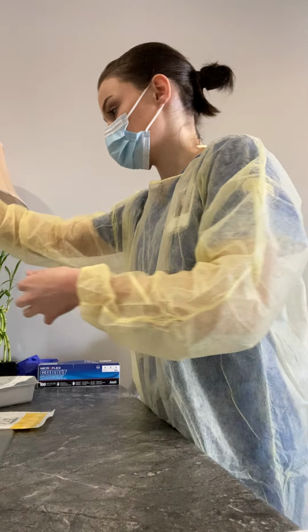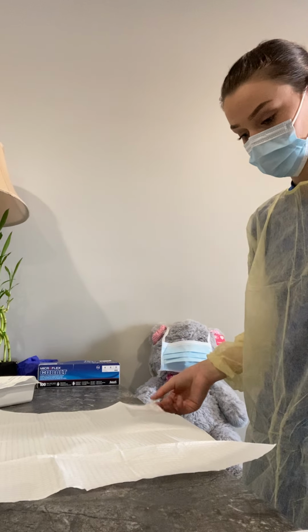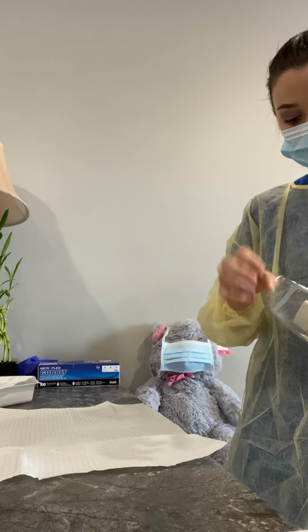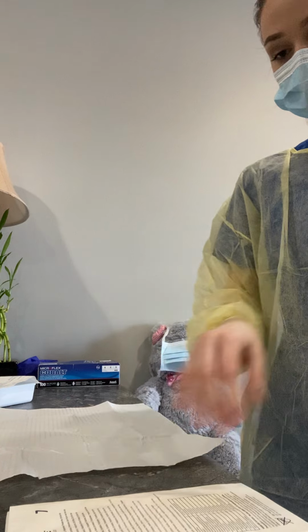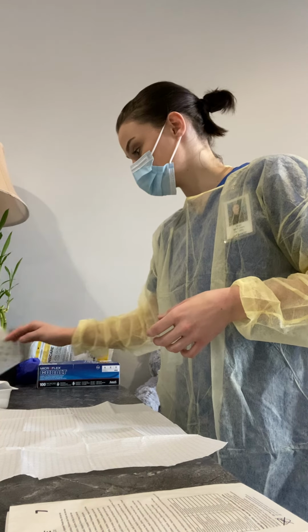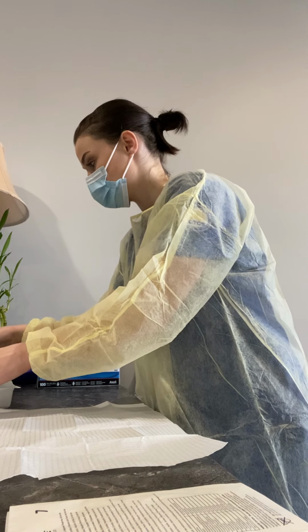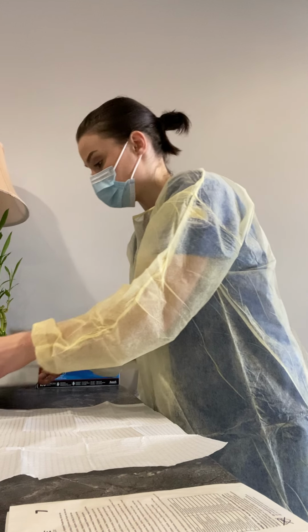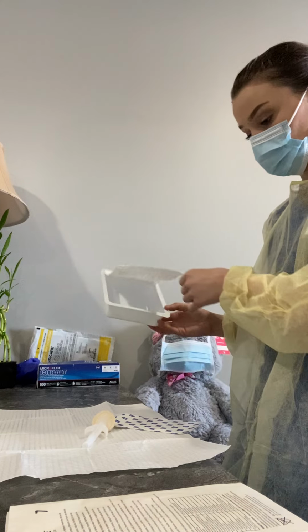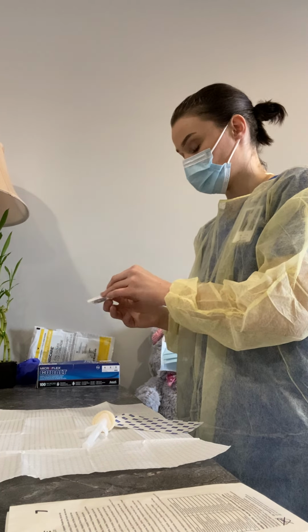So again, I've got my sterile drape. I'm going to go ahead and open this up. I have my sterile gloves to put on. Okay. So this was from my dressing change kit. So I'm going to go ahead and dump that stuff on there. Don't fly off. I'm going to throw on a Luer lock.